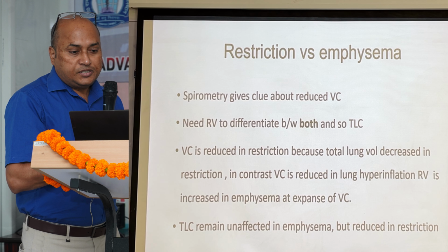What is the difference between restriction and emphysema? If we see, the vital capacity is reduced in both conditions, but vital capacity in emphysema is reduced at the expense of residual volume. Because in emphysema, residual volume is increased and TLC remains normal or unaffected. Whereas in restriction, TLC decreases, and residual volume either remains the same or is reduced.